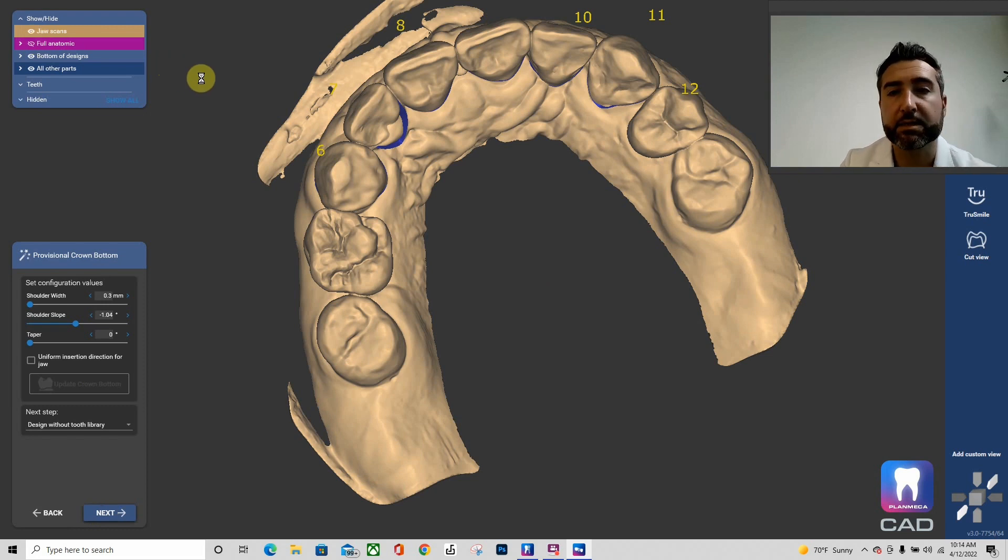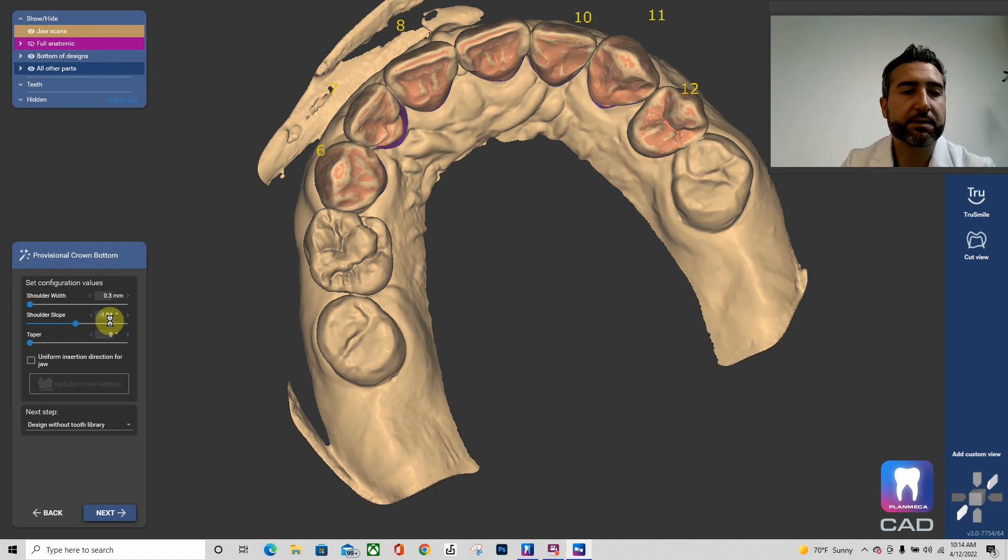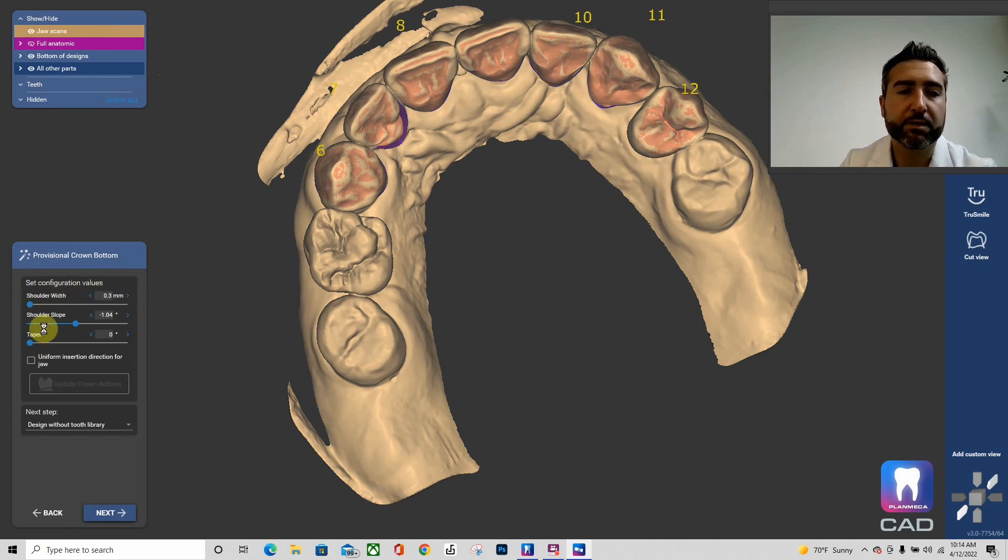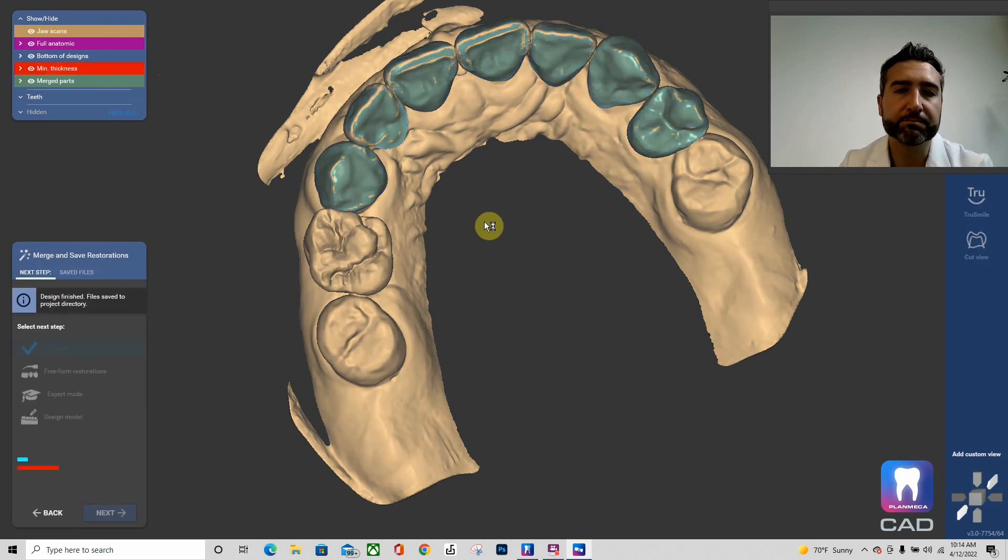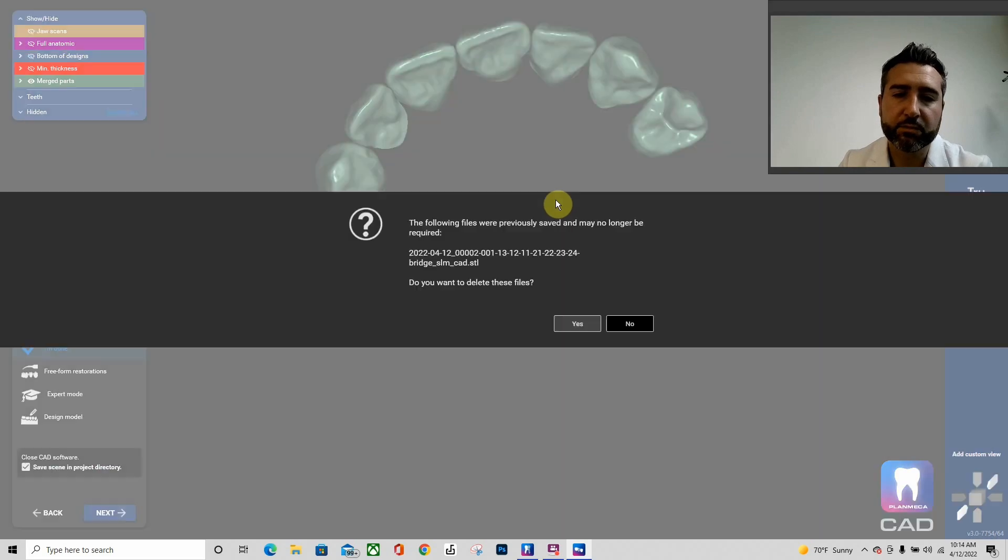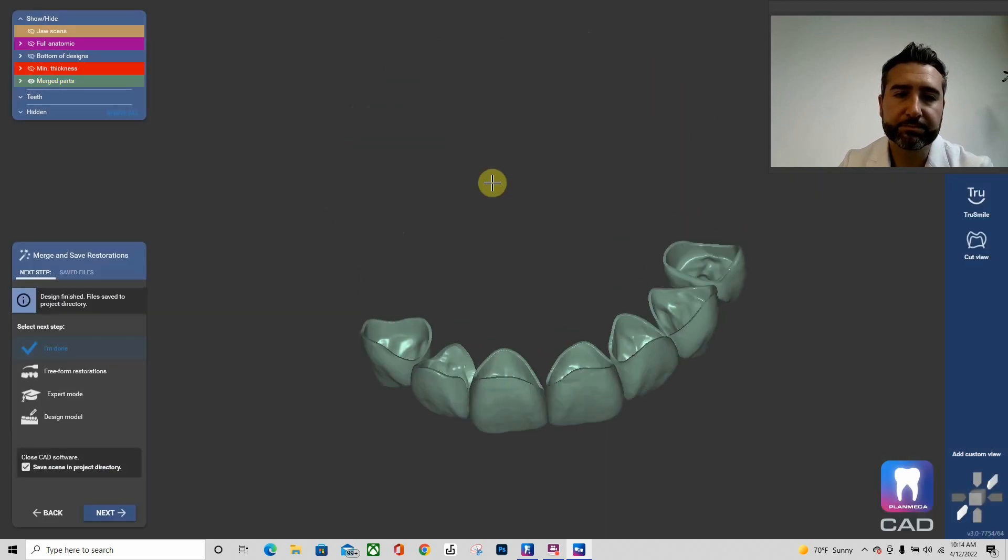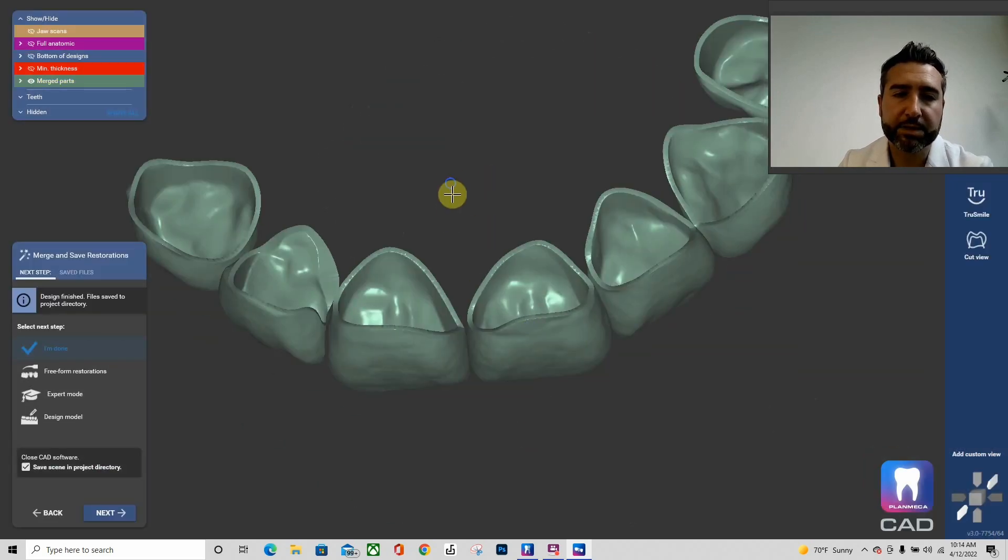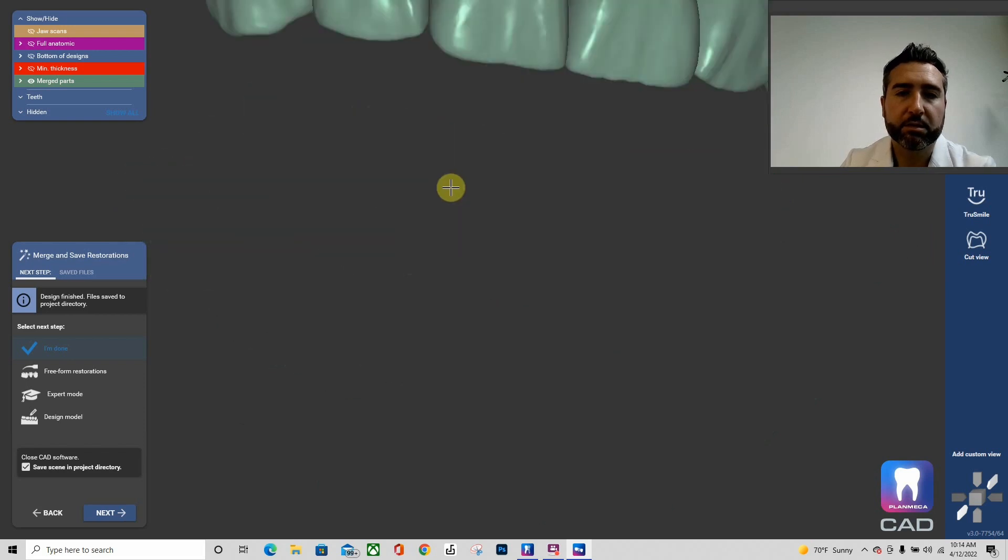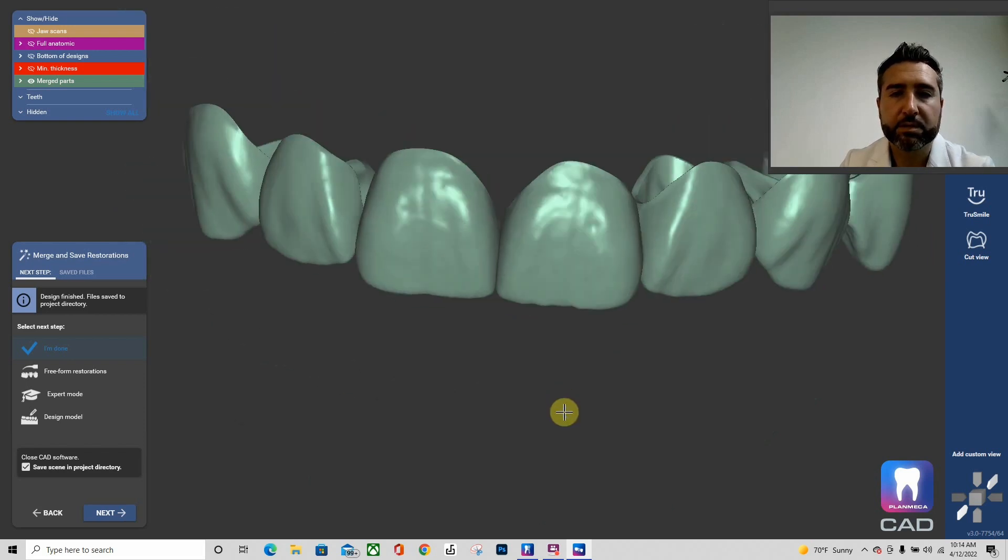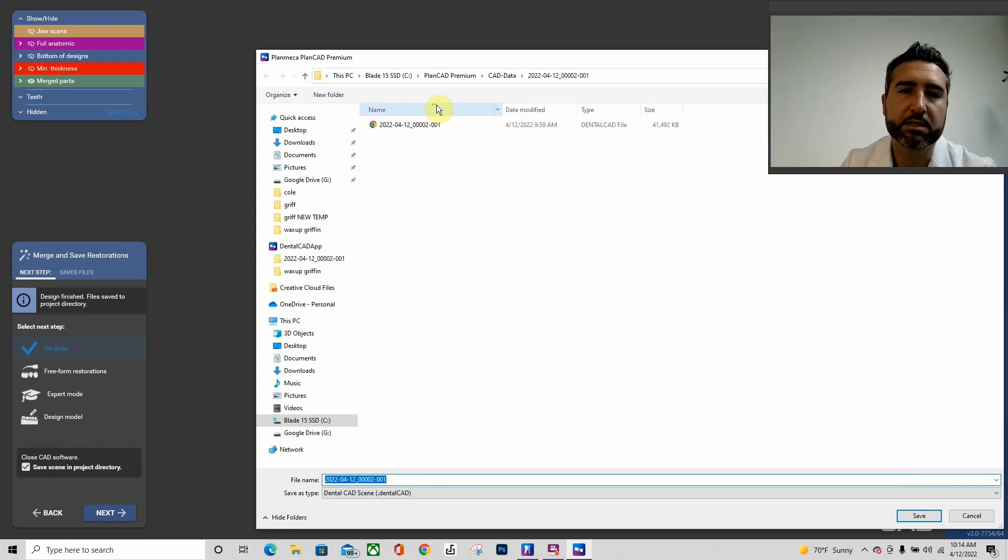And it's going to now create the actual shells. Everything is default to what we said at the beginning of the provisional software. So here's our shells, perfect, ready to go.